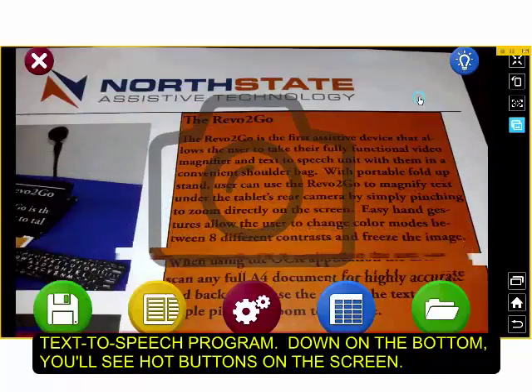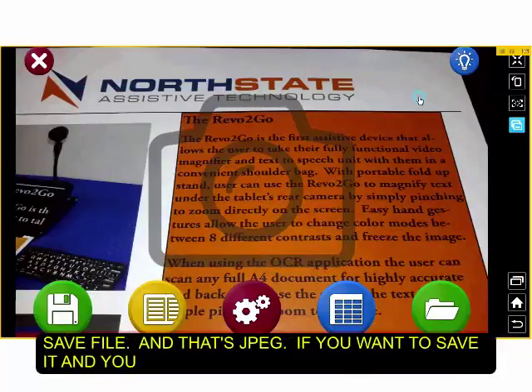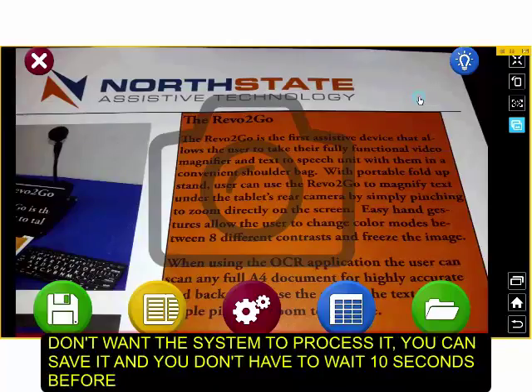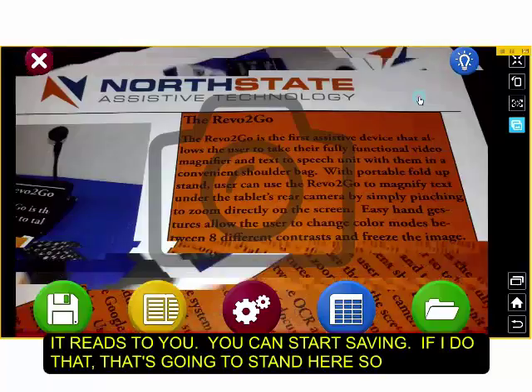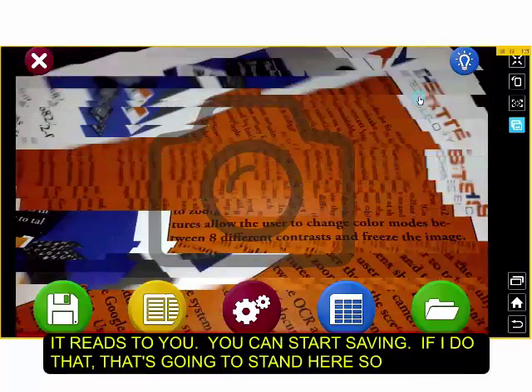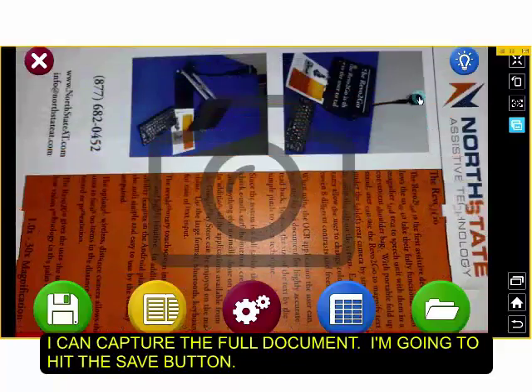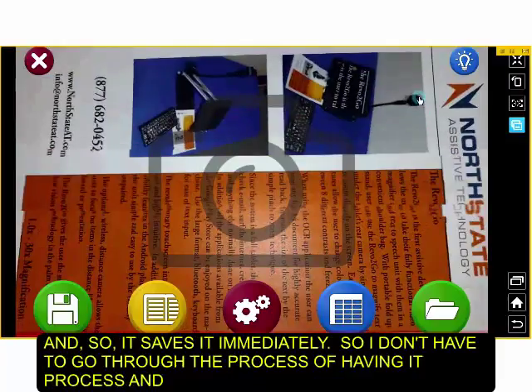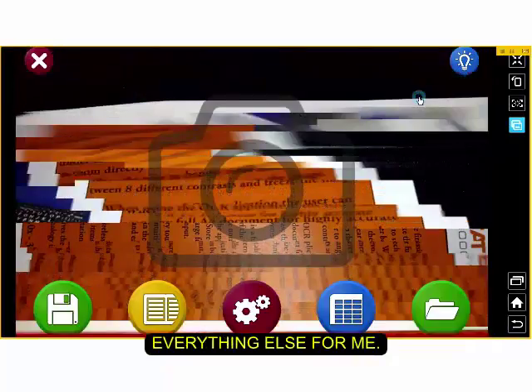Down on the bottom you'll see hot buttons on the screen. The first one on the left side is actually the save file, and that would be saving it as a JPEG. That way, if you're wanting to take a bunch of saves and you don't want to have the system process it, you can save it straight away. You don't have to wait for 10 seconds and let it start reading to you before you save it. I'm just going to bring this stand up a little bit so I can capture the full document. I'm going to hit the Save button, and so it saves it immediately. So I don't have to go through the process of having it process and everything else for me.